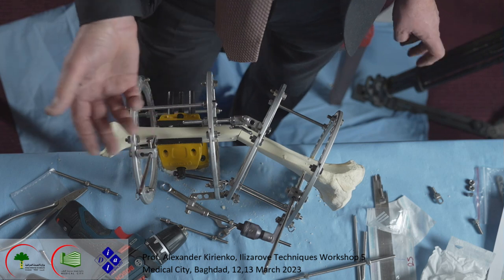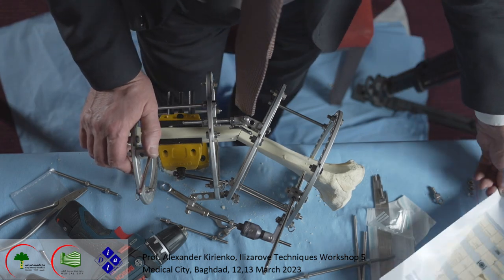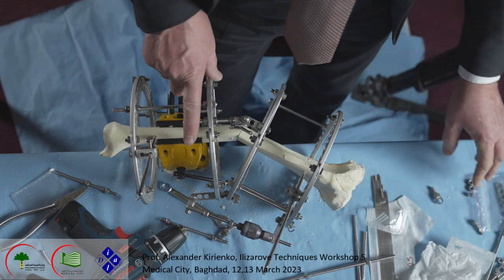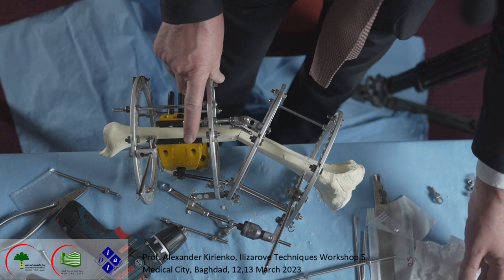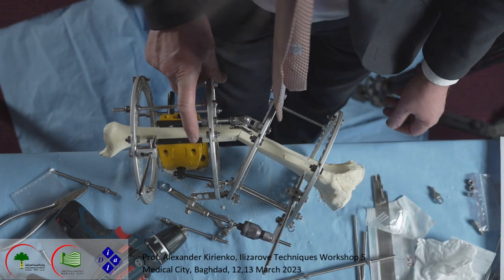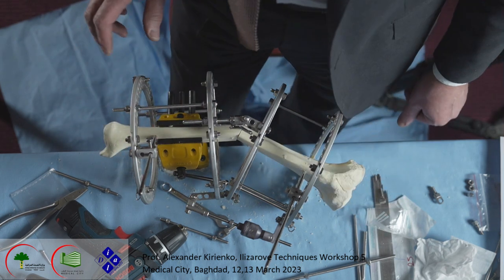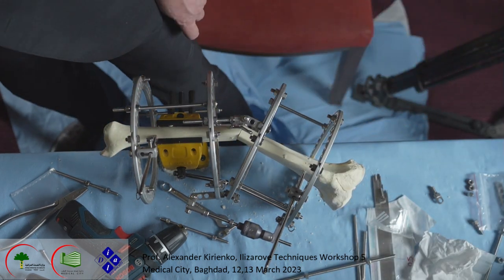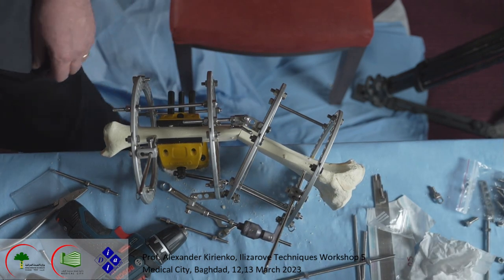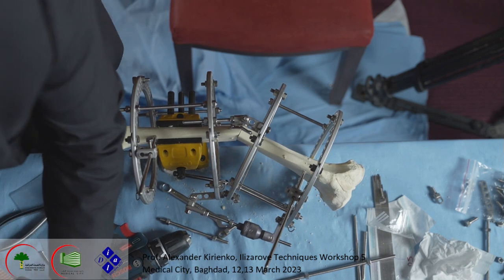Another system that, if you want it, we do it only for explanation. What we may do? We may do this inside of the system. Maybe we have two-hole posts again, female or male. Oh, we'll find it somewhere. Yeah. It was here. It's only for showing you.